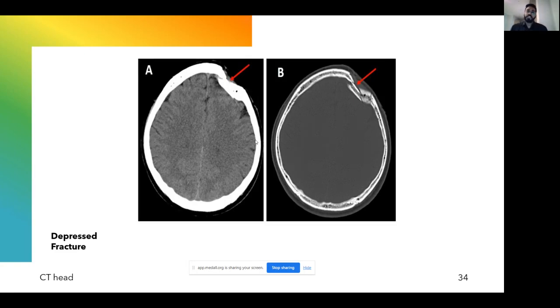So today what I want you to keep in mind most importantly is about the Hounsfield units that helps you to differentiate different structures, the orientation, your left being patient's right and your right being patient's left. Also remember about contrast phases, the arterial and the portal venous phases, and also windowing as well. And with regards to CT head, always remember blood can be very bad.